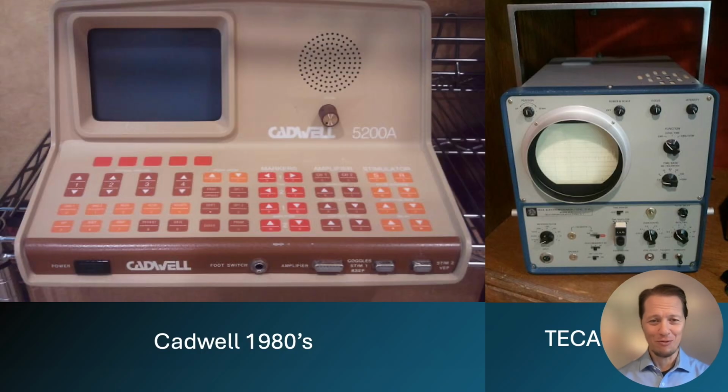If you were interested in further historical pieces, this is actually from the 1960s. I would not want to do EMG on that. And I use Cadwell. This is one of the early Cadwells from the 1980s. Man, that must have been a tough time to do EMG. We got it made right now. All right, we got a little off topic there.